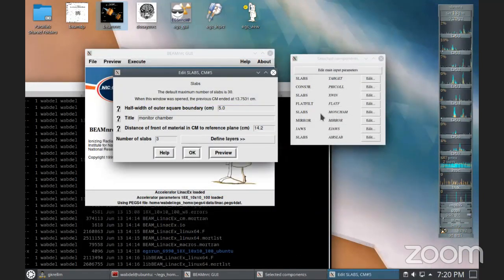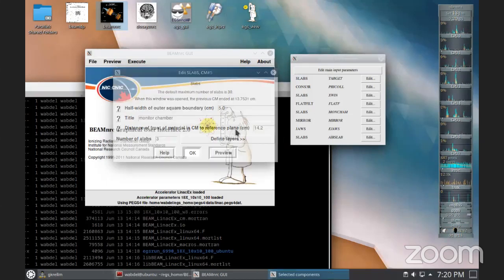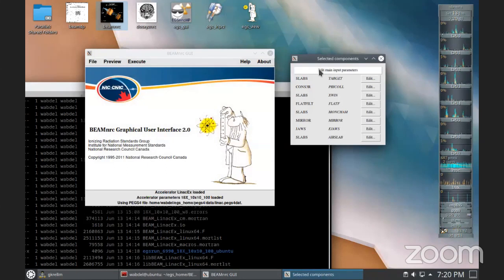So this is the first output. We want a dose to be scored in a certain region in a linear accelerator. This is not an interesting output, except for the monitoring chamber, but no one would really want to know the dose delivered in your jaws, for example, or in the MLC, okay? That's not of interest.